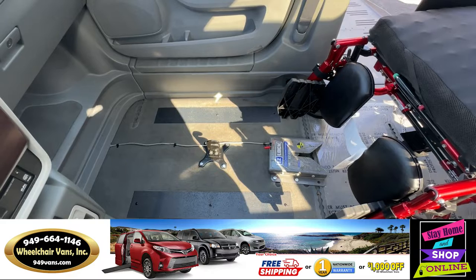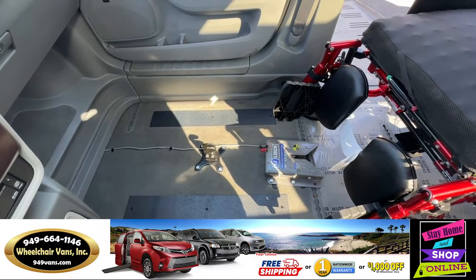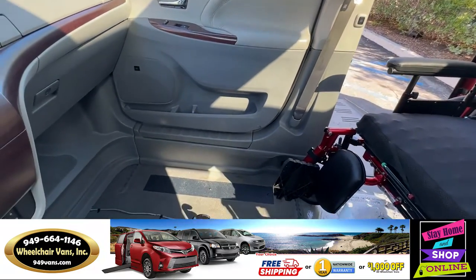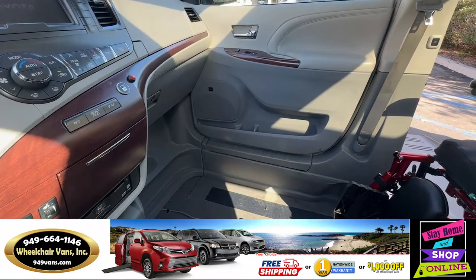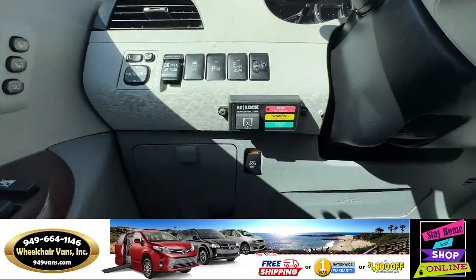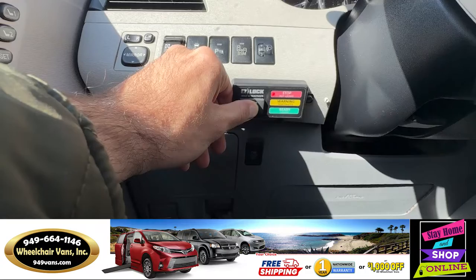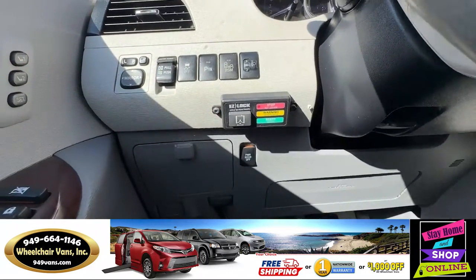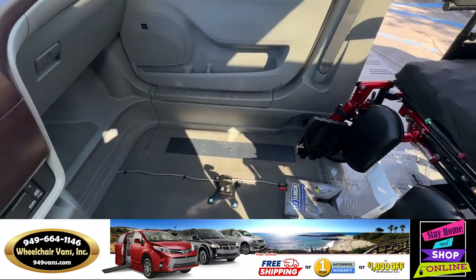If you want to drive the vehicle without transporting anyone in the chair and need to bypass the security feature, you will first turn on the vehicle. In order for the security feature to be disabled, you will need to keep your hand on this button. The system will announce 'Lock deactivated' and now you can drive the vehicle without anybody being there.